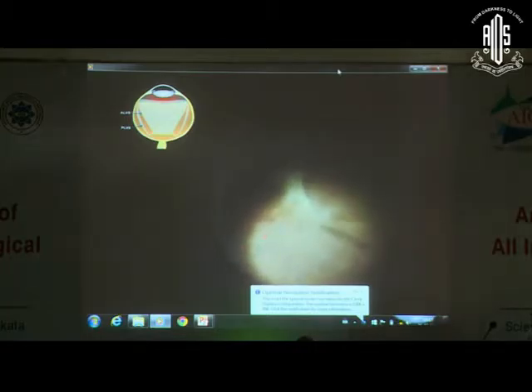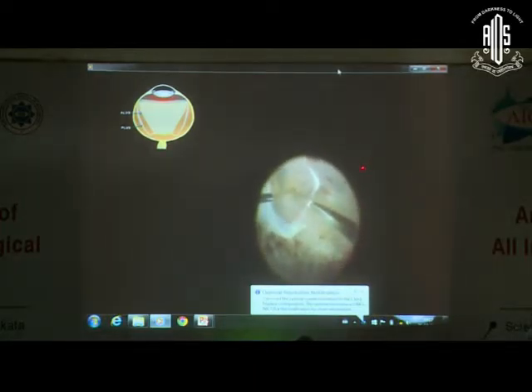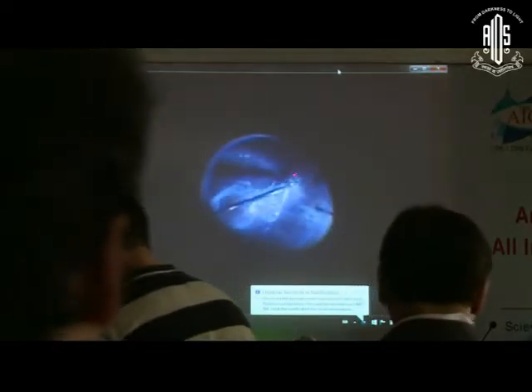This is an old vitreous hemorrhage, a long-standing one, where this again appears to be the posterior hyaloid there, but that's again the anterior leaf, and the posterior leaf is coming off later, as you saw with a wave there. And it's only then, when you've got that sheet off, that you can excise the rest of the tissue. Sometimes you have these anterior extensions, and that makes the case very tricky, especially in a phakic eye.